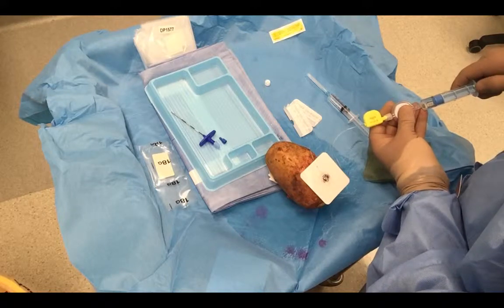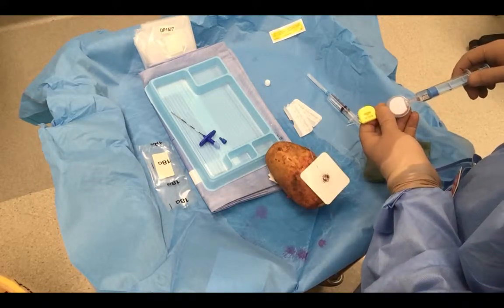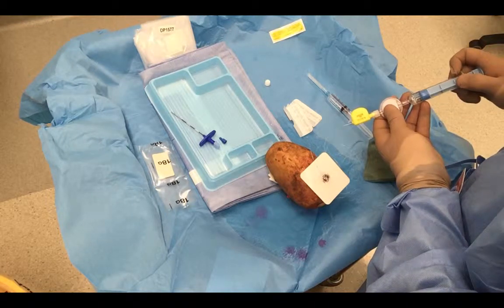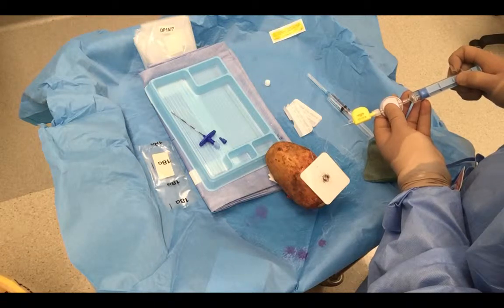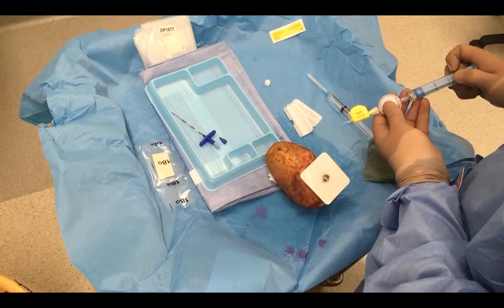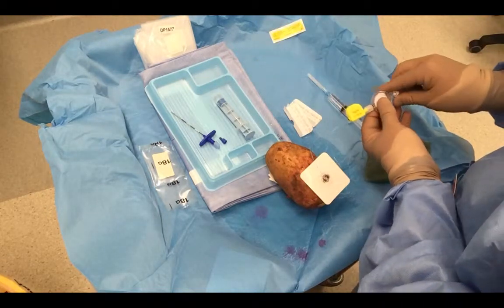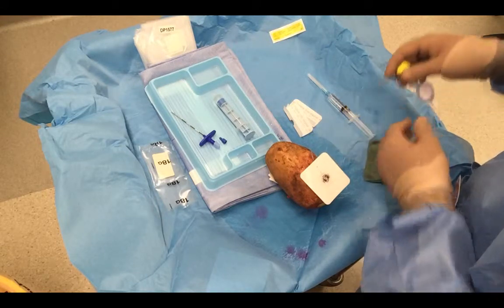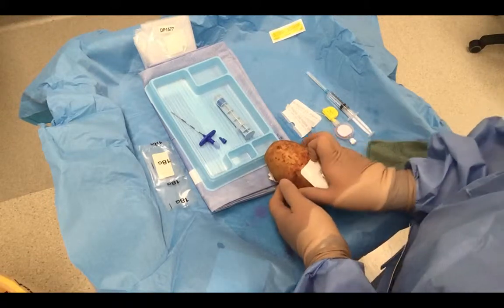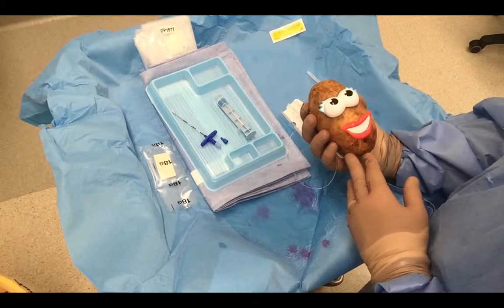Aspirate. Unable to see any blood or potato fluid in the catheter, and it flushes very nicely. At this point, on a real patient, we will begin the first of our test dose of local anaesthetic. I'm going to apply my catheter and affix a dressing, but essentially the procedure is over. Now let's have a look. She's much happier with her epidural analgesia.